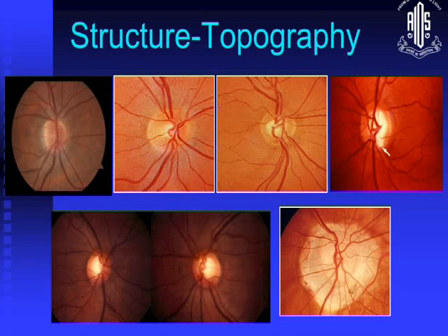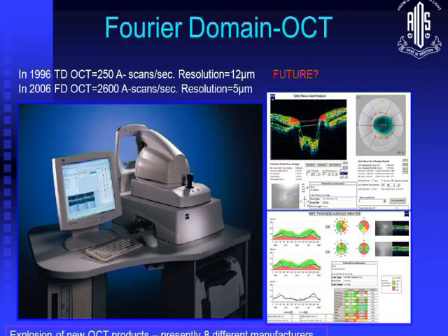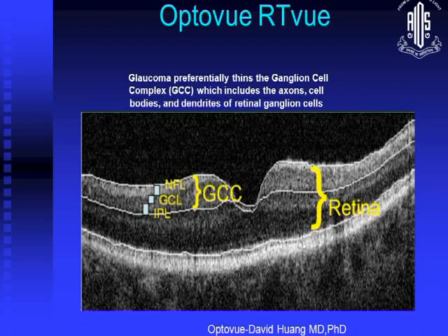Now this becomes a difficult situation, and of course in high myopias with parapapillary atrophy, it is very difficult. So you have the structure, but again there is an individual variation, and sometimes it's not easy to assess. We have so many machines available now for OCT, at least about 8 of them. We were able to do with 12 micron, but now you can have 5 micron thickness measurement. So it has come a long way. Importance has been given to the central macular thickness with the GCC, the ganglion cell complex. So we are not only looking at the retinal nerve fiber layer, but also the thickness in the macular area.